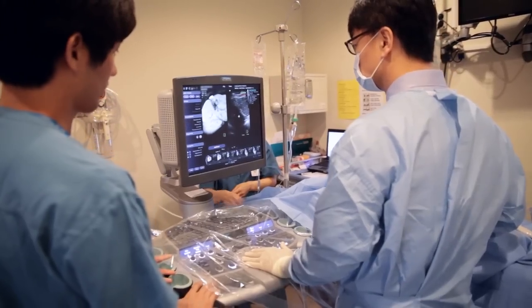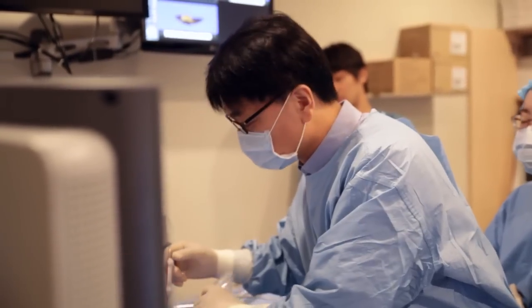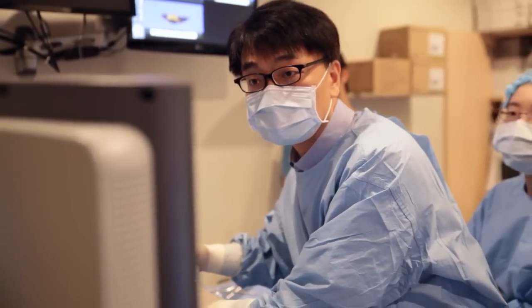My name is Jungmin Lee. I am working at Seoul National University Hospital, Department of Radiology. I've been doing RF ablation for more than 12 years and I've performed more than 2,000 cases. I'd like to share our experience in using Easy Fusion for RF ablation.